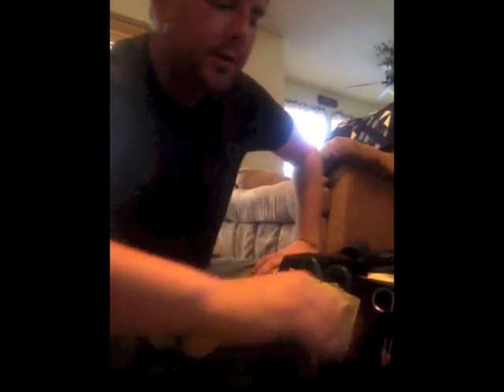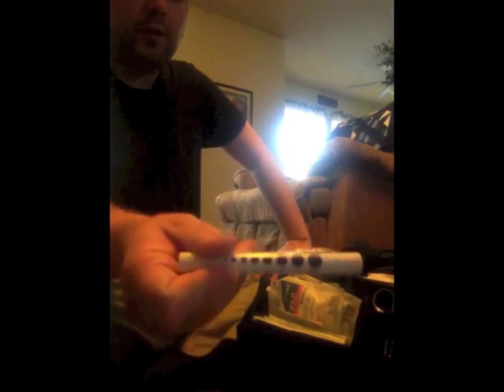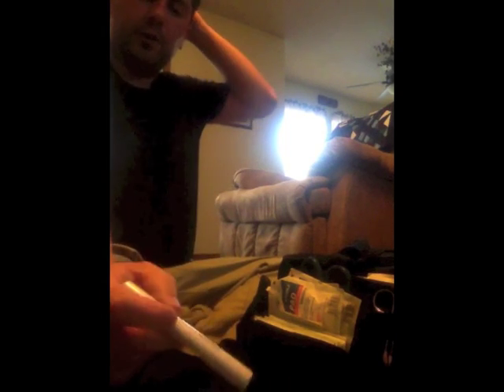What I also have is a pen light. Actually, I have two in here. This one actually has the pupil sizes on one side, and it's really good to carry because if you're going somewhere and if ALS arrives, you can just tell them, okay, we have pupil sizes of this. When they go to the hospital, there's going to be times when the doctor says, well, what was the pupil size, because that can indicate several different things in the patient.